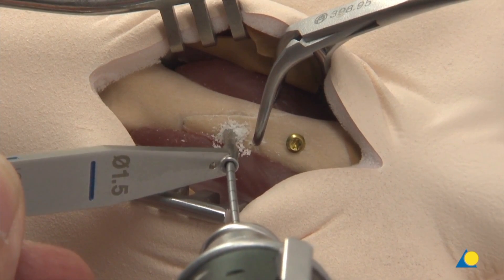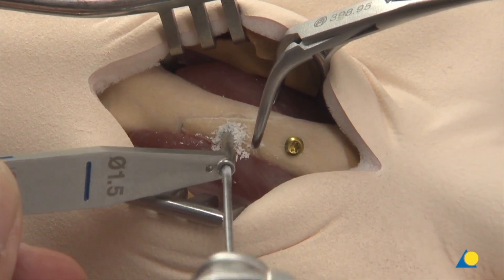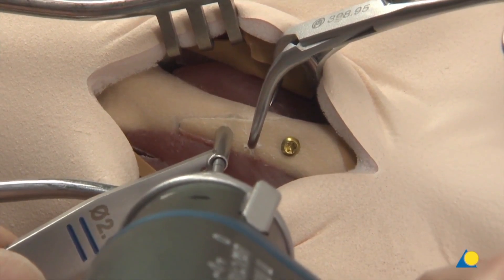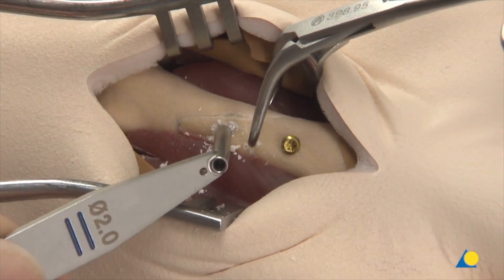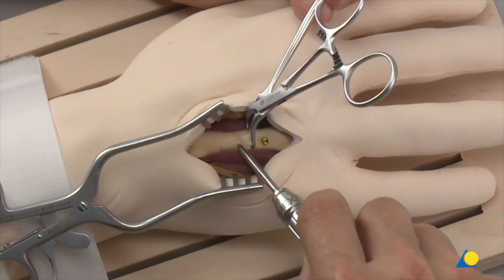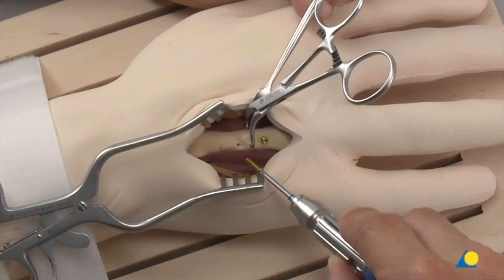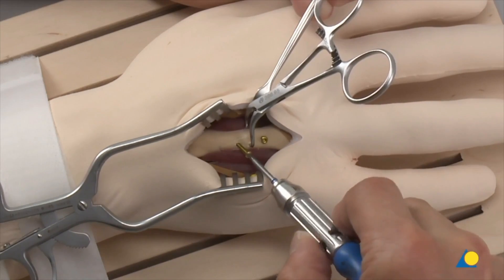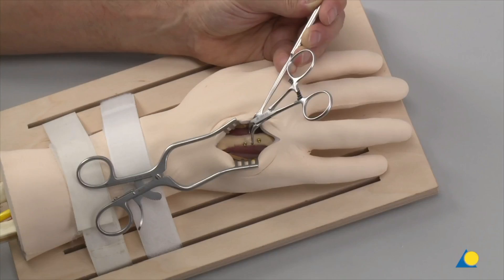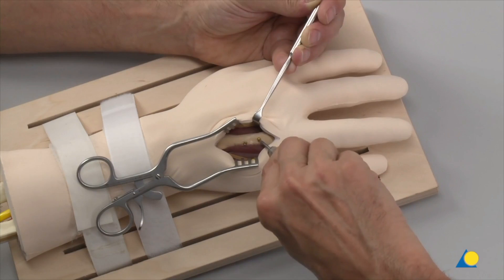The thread hole is drilled with the 1.5 mm drill bit through both the near and the far cortices. The drill sleeve is rotated and a gliding hole is drilled with the 2.0 mm drill bit through the near cortex only. The cortex is carefully countersunk. The second 2.0 mm lag screw is inserted.